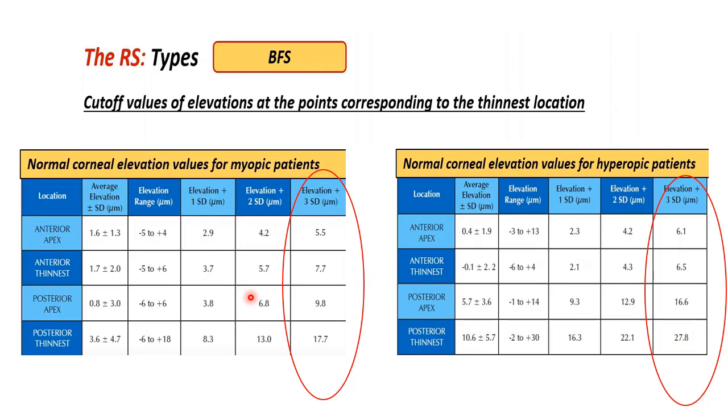So this data is commonly used by doctors, and is also found in the Sinjab Academy. This data is popular between doctors, and also in the practical sheet that has been made by Sinjab Academy, these figures have been used. So you need not memorize all these figures. However, most of the machines are equipped with an alarm system that when there is any deviation from the normative data, there will be a yellow flag indicating that he's at mild risk, or a red flag that he's at high risk.